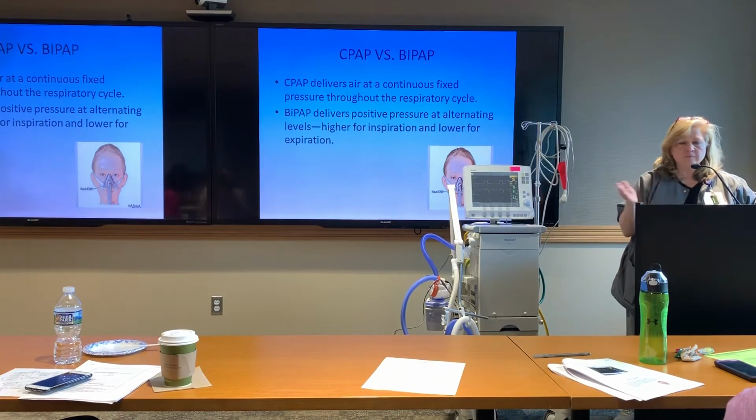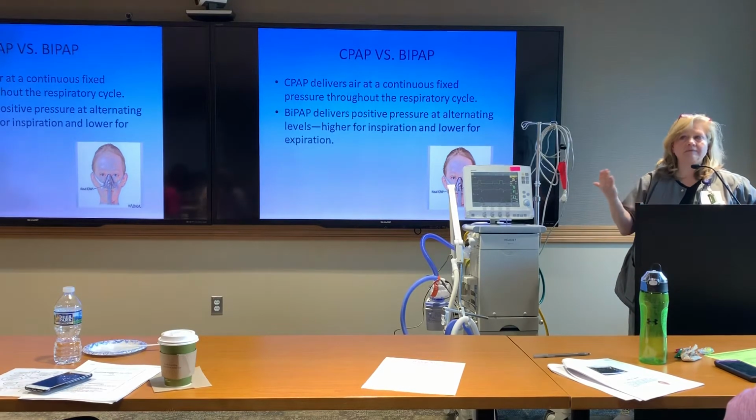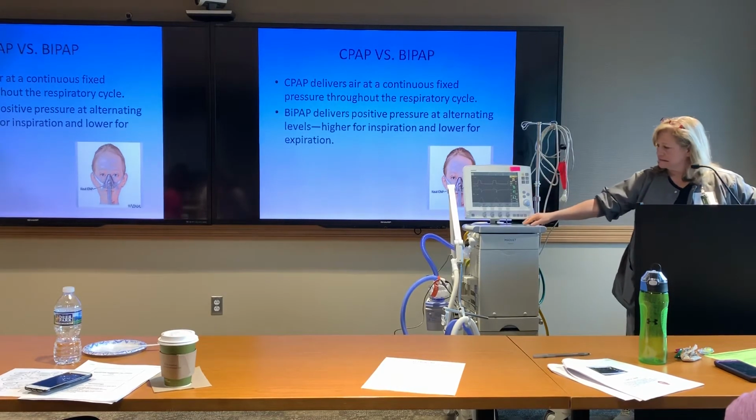So it doesn't really matter if I use IPAP or pressure support, as long as you're maintaining tidal volumes and following what the patient's getting and you're not letting him get short of breath. Does that make sense? No? Yes? Maybe? Hopefully. Okay. Good.